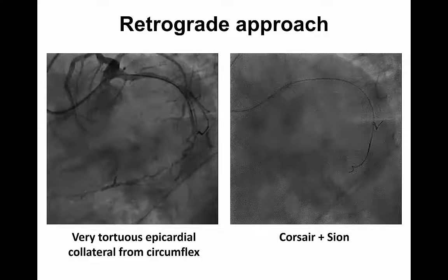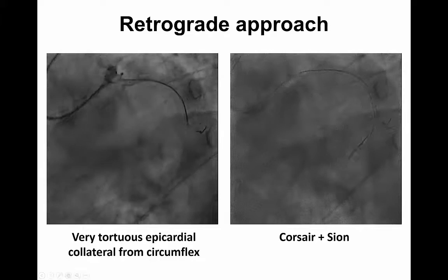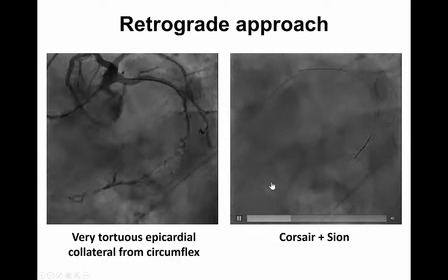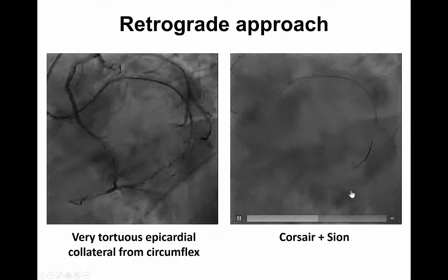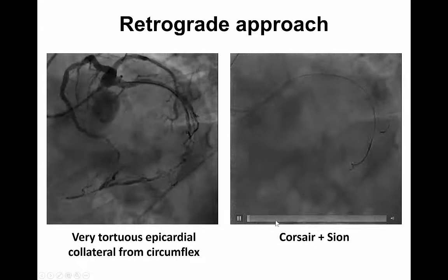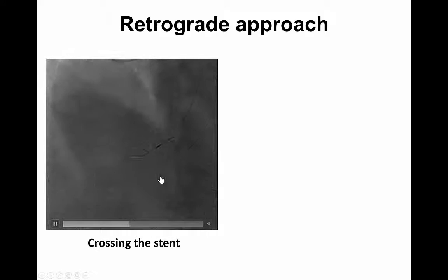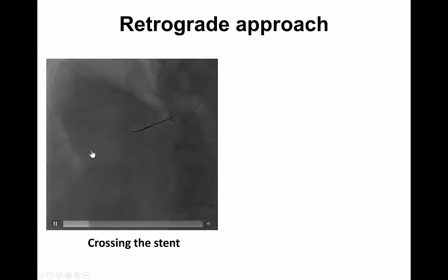Accordingly we switched to a retrograde approach through a very tortuous epicardial collateral from the circumflex, as you can see here. This is a Corsair microcatheter and a Sion wire navigating the very tortuous anatomy. At a certain point the wire jumps into the distal true lumen. The Sion wire very quickly crossed in what we believed was a true-to-true lumen fashion into the proximal vessel and also into the anterograde catheter, as you can see here.